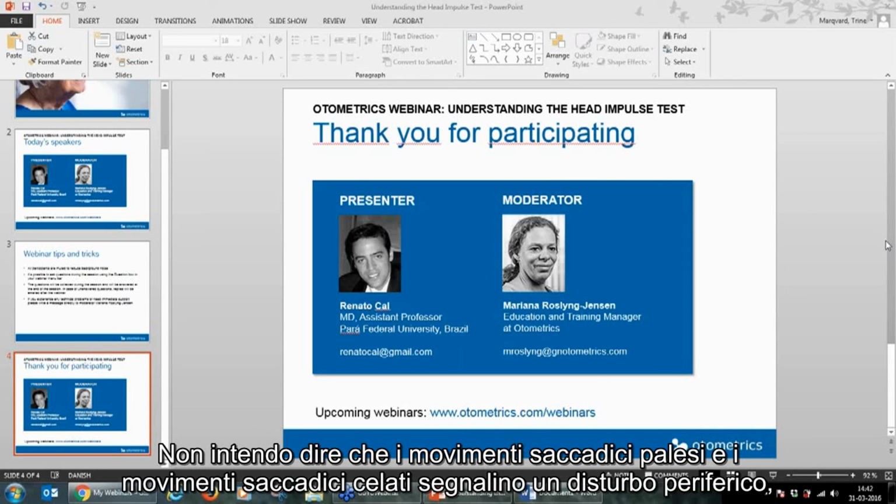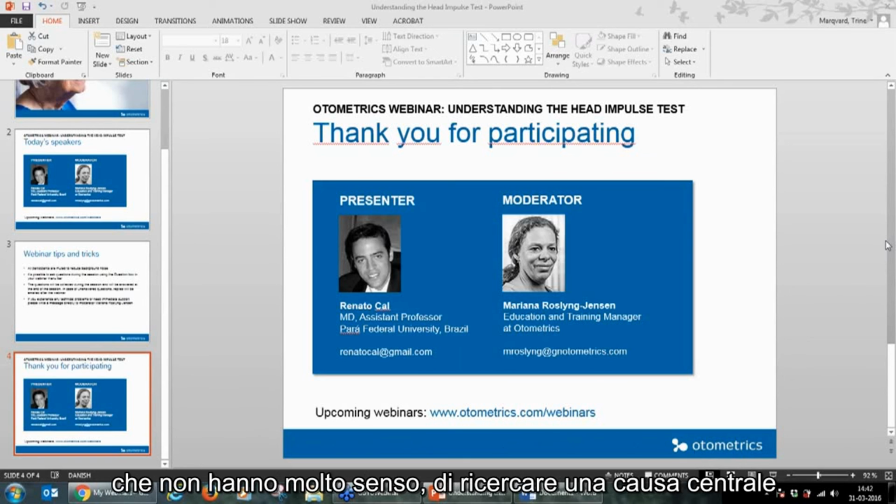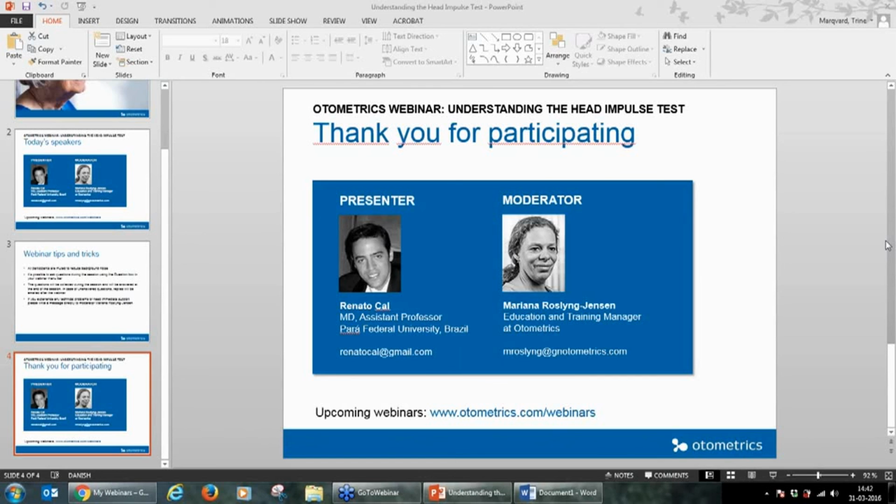Or if you have a low gain but no saccades at all, something is wrong. I'm not going to tell you that overt and covert saccades mean peripheral disease, but I do recommend that when you perform a vHIT and you get some weird results that don't make sense, look for a central cause.